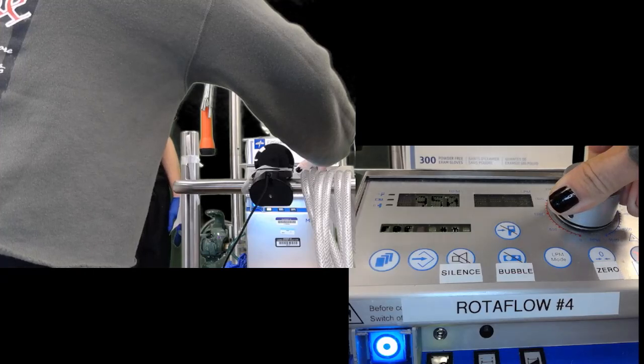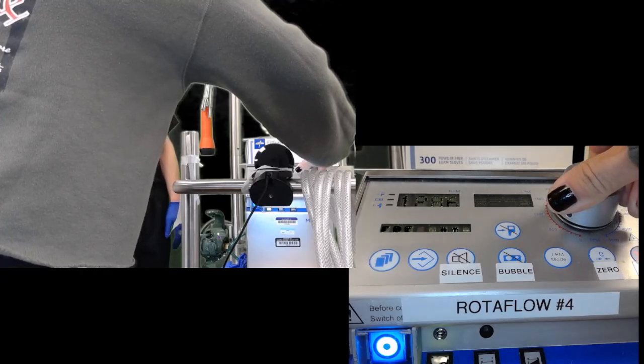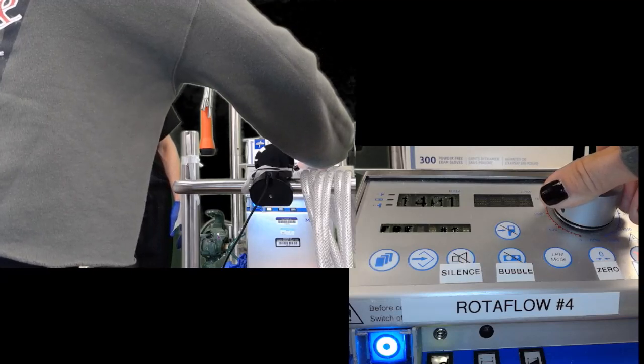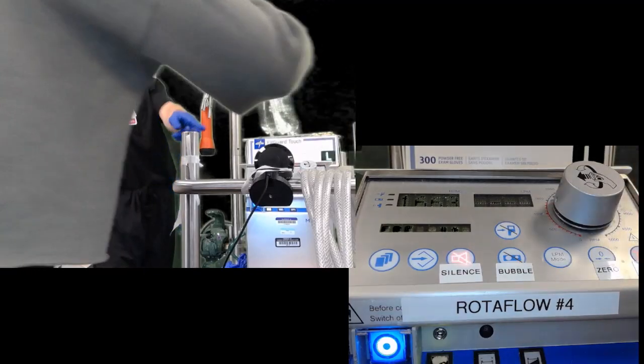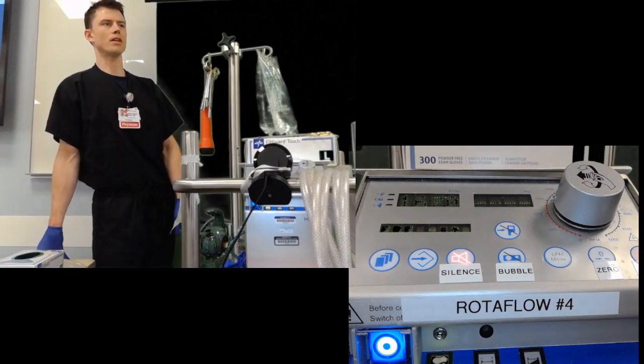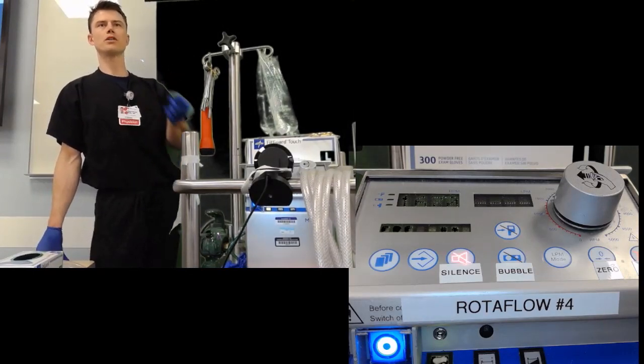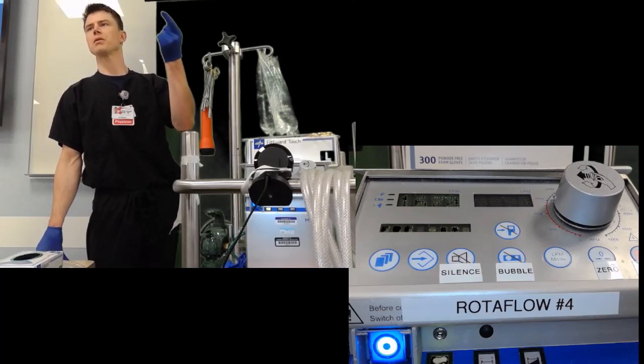You can read out, what are your RPMs now? 1157, 1286, 1353. Okay. What's happening with your flow? No flow. No flow, okay. So this is another thing we'll point out with this machine that you may have encountered. We control the RPMs, how fast the pump's moving.